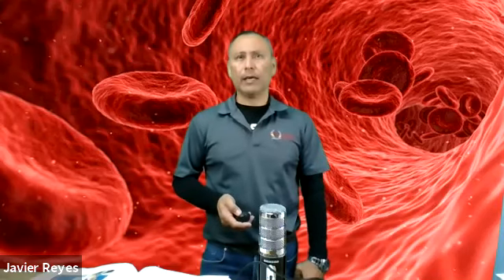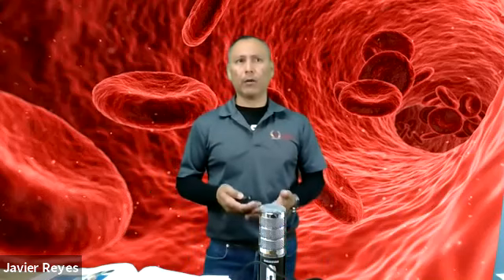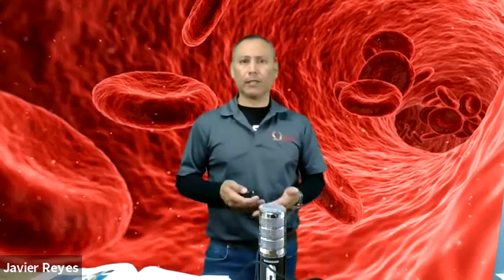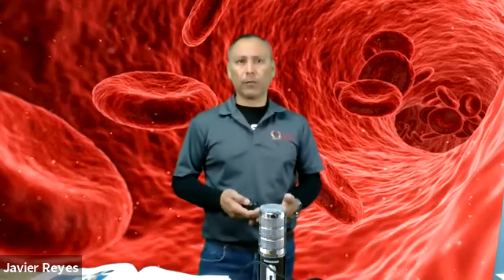Okay, you have the syringe. The syringe is the one that is used to collect the specimen. Now, again, this may not be within your scope of practice. This may be for an advanced phlebotomist or even respiratory therapists, who are usually the ones given the task to collect capillary blood gases because they are trained to perform this procedure.